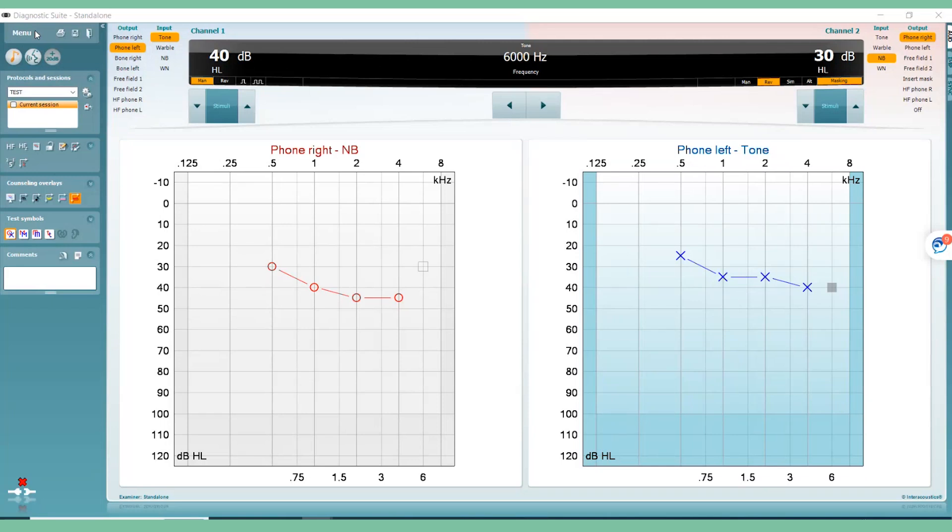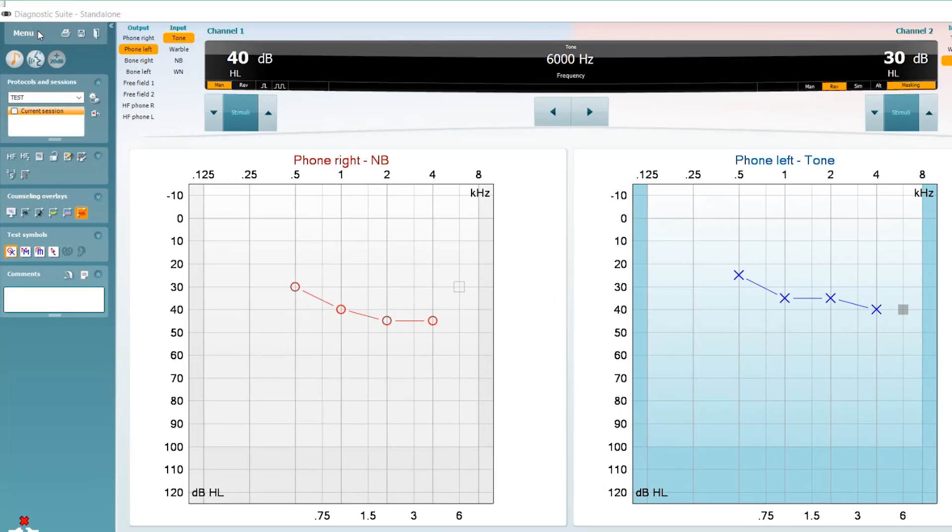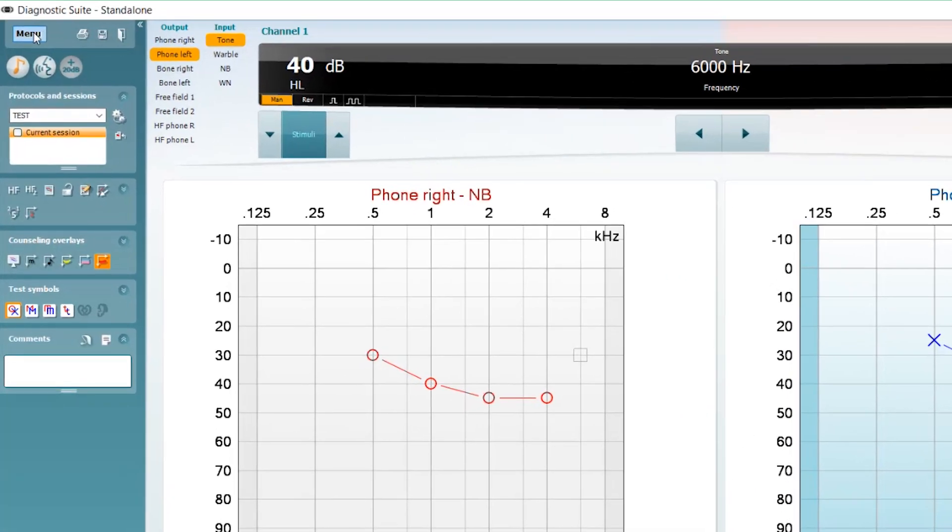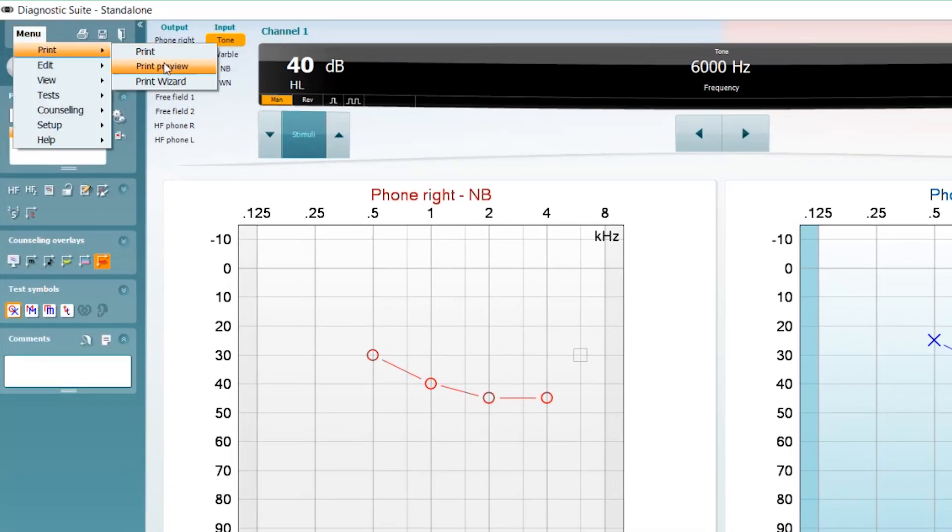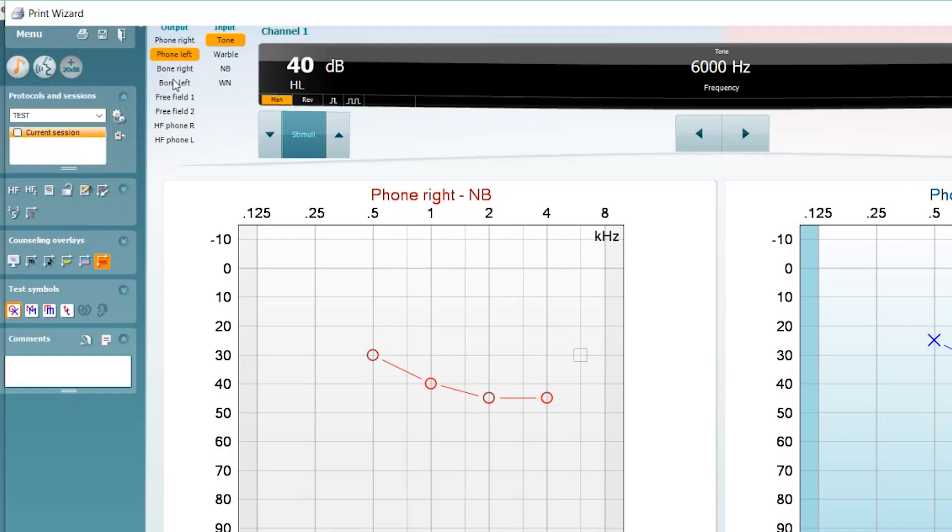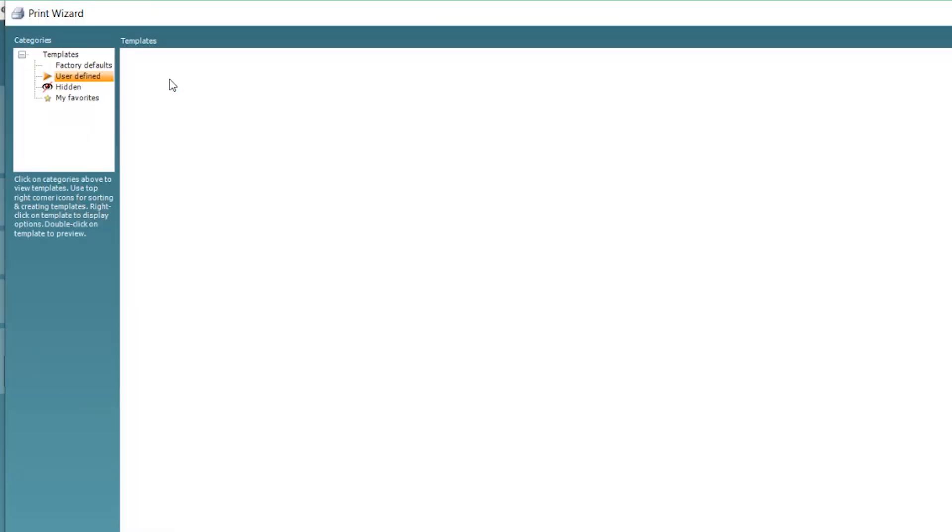If you have a database, patient information can also be printed out. Open your Suite software and navigate to Menu, Print, Print Wizard. You can choose to copy an existing layout and modify to suit your needs or create one from scratch.